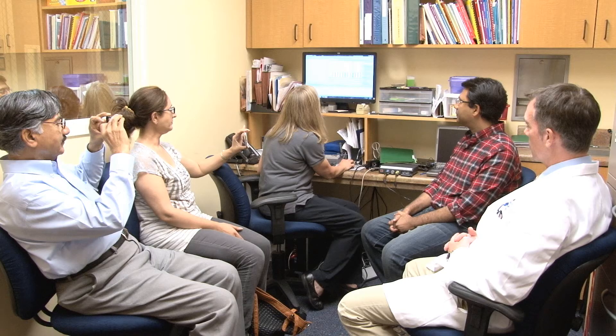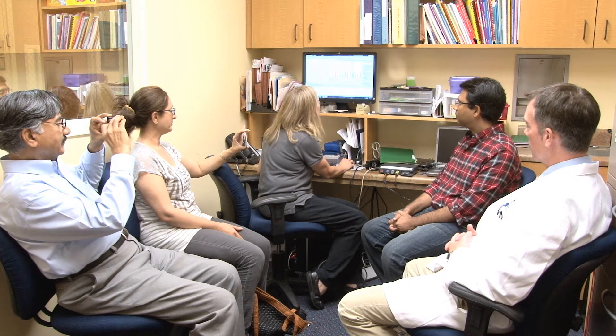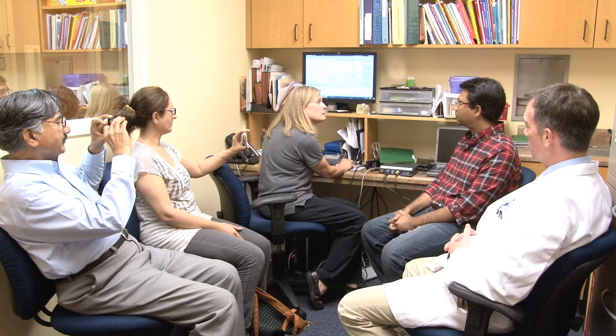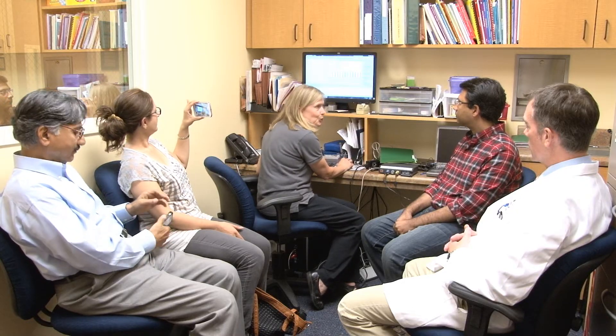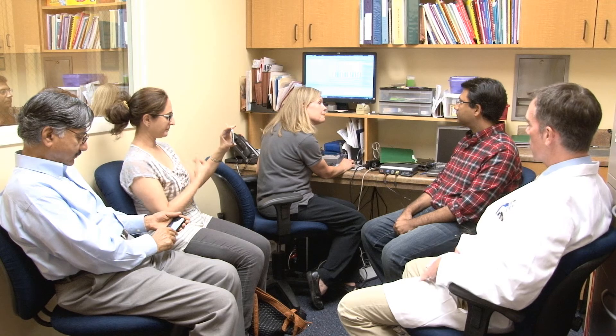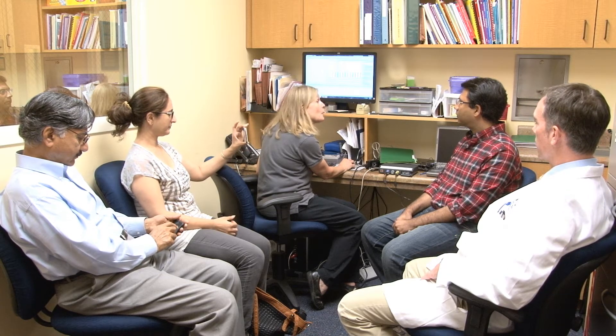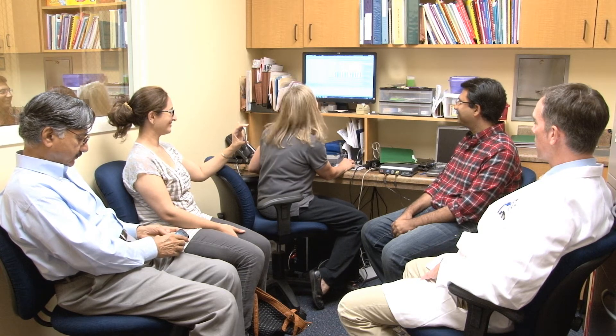Now I'm going to let you listen to a few other electrodes and just make sure it's comfortable on those. Do you hear that? Is that okay? Yeah. Make it a little bit louder. Yes. That's pretty good? Yeah, that's good. Now this is going to be a lower-pitched one. Do you hear that? Yeah. Is that pretty good? Yeah. It's quite soft. You want me to try to make it a little bit louder? That's fine. That's good right there.